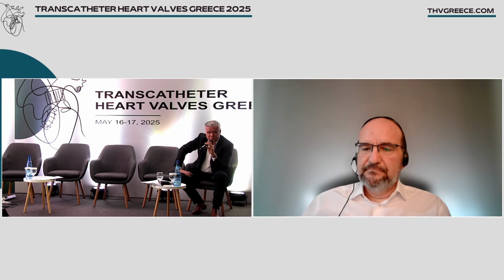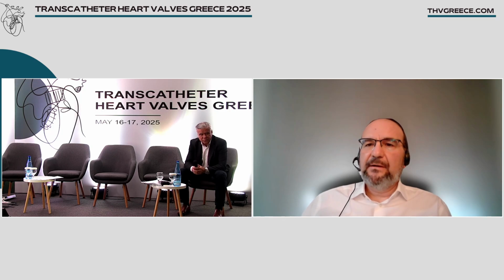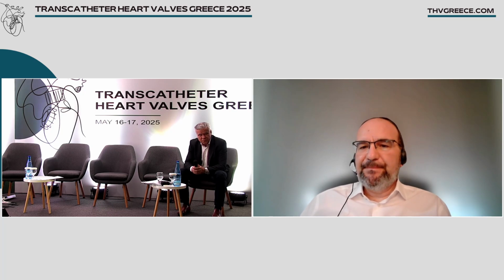And this is something that has been reported many times. So I think this planning, the CT planning, must be very accurate. And I think if there's a question about the outcome from the CT planning, you should stent. And you rightly did that.